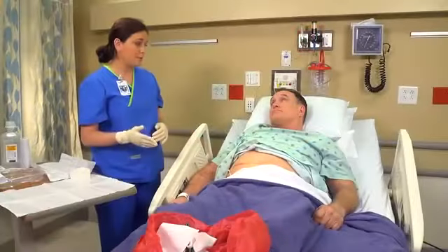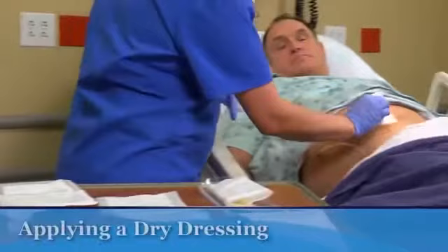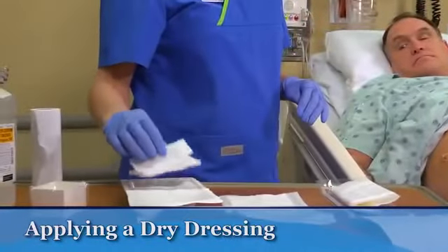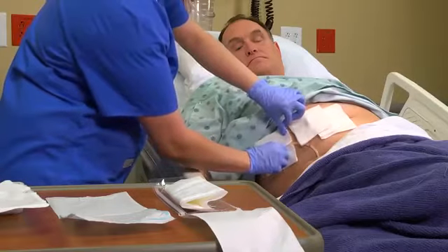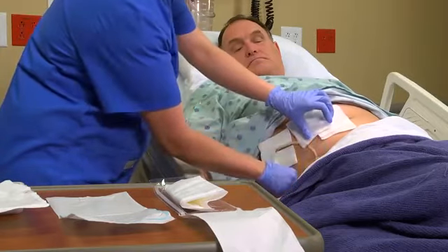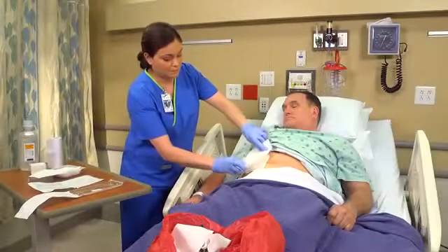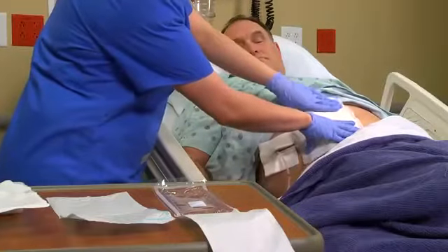Now that your wound is clean, I'm going to dress your wound. To apply a dry dressing, use loosely woven gauze as a contact layer. If the wound has a drain, place a pre-cut 4x4 gauze pad so that it sits flat around the drain. Apply additional layers of gauze as needed. On top of this, apply a thicker woven pad such as a surgi pad or abdominal dressing.